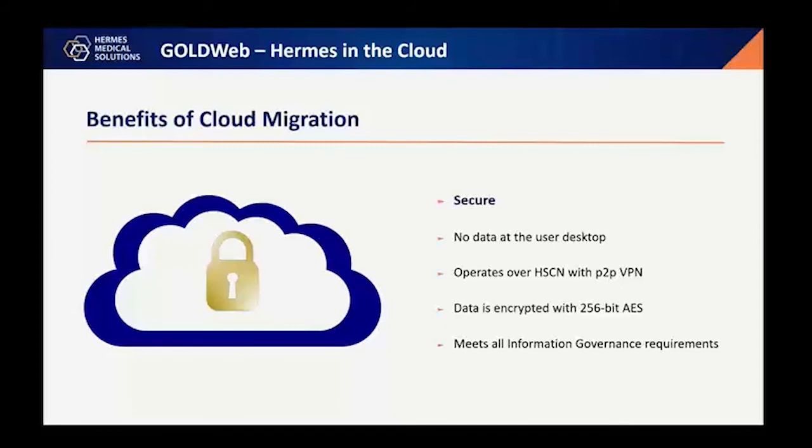And the final, probably maybe most important benefit of this cloud migration is security. So with thick client implementations, smart workstations and things like that, we have patient data at a user desktop, where that desktop device can be picked up and taken out of a department.